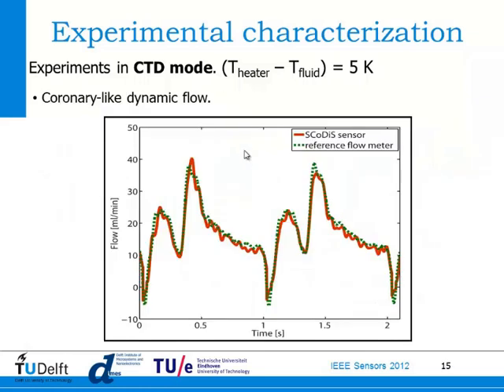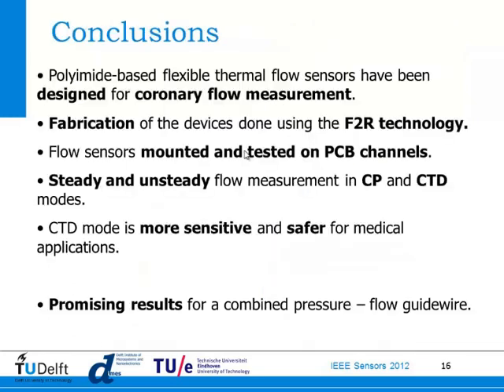However, we have been able to follow coronary-like dynamic flows quite well using this technique. You see in green here the reference flow meter we had for experiments, and in red what are our results. I think they are quite good.